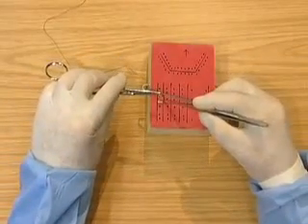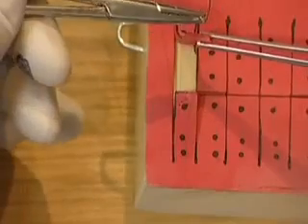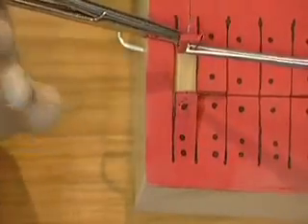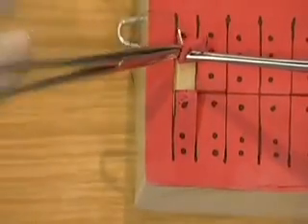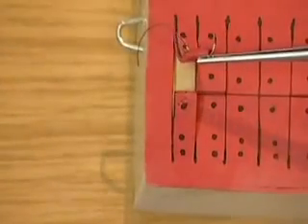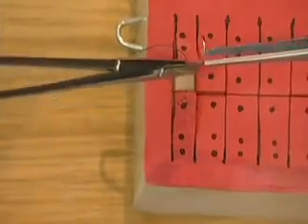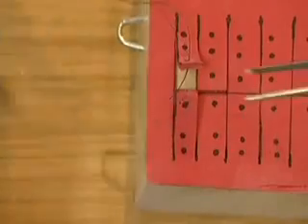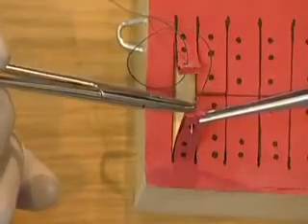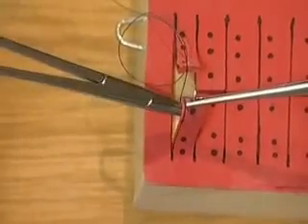Pick up the flap with the tissue pickups. Insert the needle. Pick up the needle with the tissue pickups. Pull the needle through with the tissue pickups. Take the needle with the needle holders one third from the swaged end. Pick up the flap with the tissue pickups. Insert the needle through the flap. Take the needle with the needle holders. Pull the suture through.